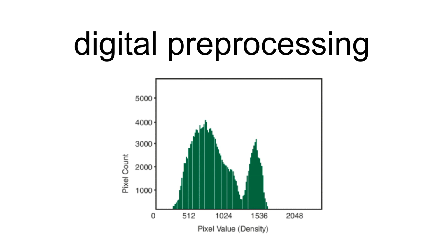There is a communication that then has to take place between what you have generated and what the computer for that exam thinks is optimal. That communication takes place by one histogram essentially talking to a specialized histogram. So, what is a histogram?